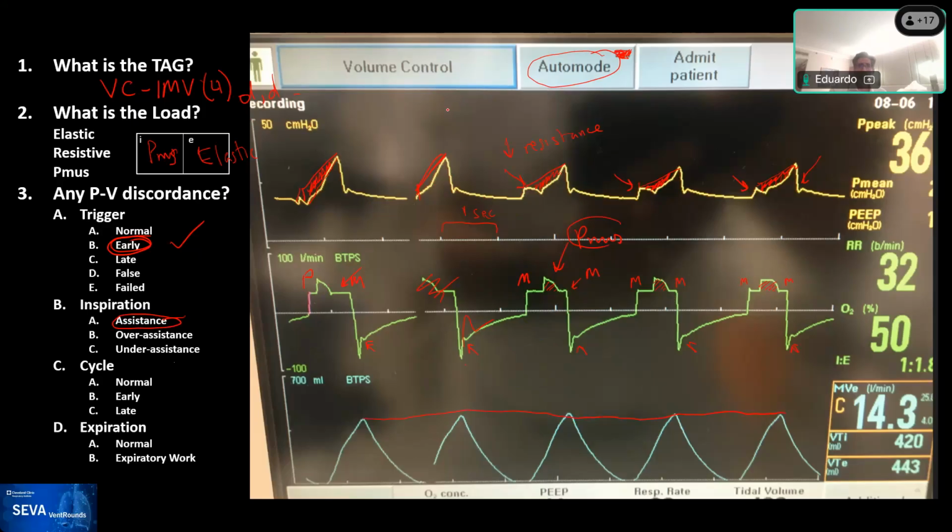I want volume control. I don't want to use anything else. But you can see how in this case, for this particular patient, the ability of the mode to change avoided a situation in which it could cause severe under assistance. And obviously it has to do with your goal, but at least in these circumstances, the mode is doing what it was designed to do to prevent.